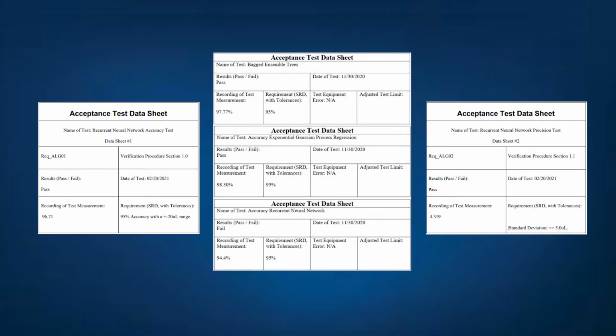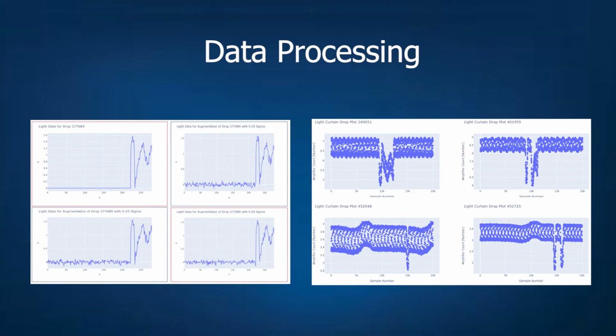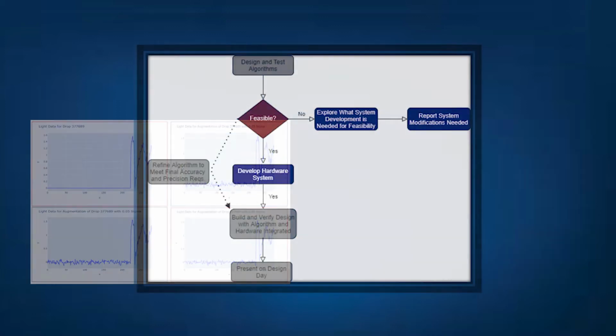Our best performing model, based on the tested accuracy and precision, met and exceeded our system requirements on the stored light sensor data by using a recurrent neural network with custom pre-processing, which served to distill plots of 20,000 data points down to 128, allowing for faster computations and reduced storage size.